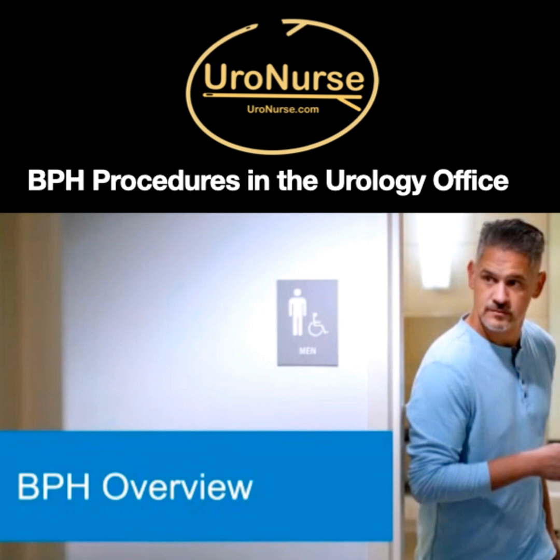All right, so what are some of the key take-home points with Rezum? It works really well if you've picked the right glands, and I didn't really discuss that in detail, but what are the right glands? I believe it's FDA approved for glands from 30 to 80 grams in size. The really huge glands, neither of these minimally invasive therapies are going to be really good. The treatment is really durable, 4.4% surgical retreatment rate.